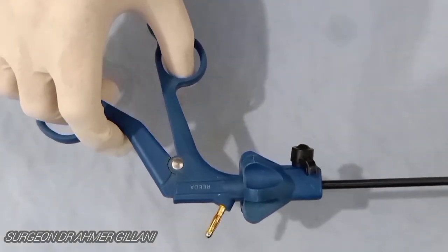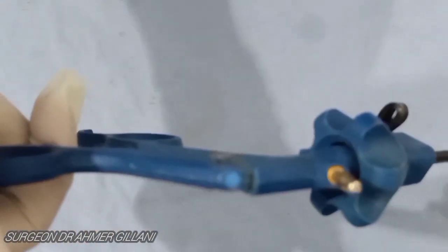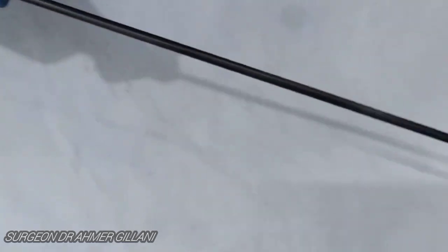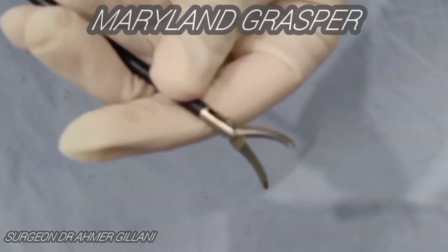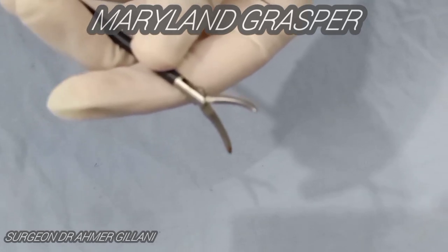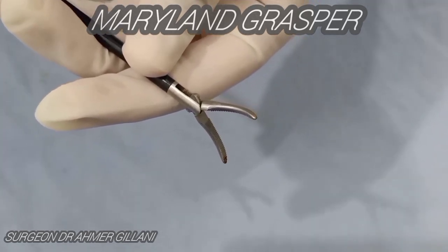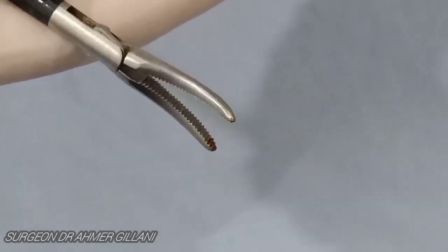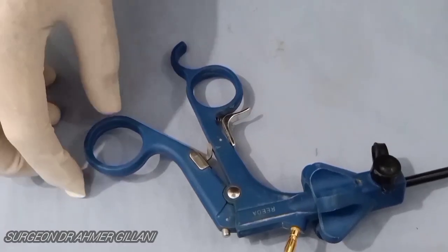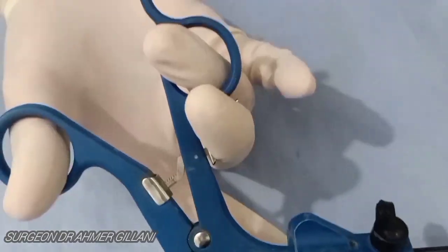The next instrument is the most commonly used instrument in laparoscopy and is known as the Maryland. Some surgeons call this instrument a Crile. It has a fine tip for grabbing a small bit of peritoneum but a relatively long length, allowing it to spread very wide when used for blunt dissection. You are seeing the close-up view of this Maryland.